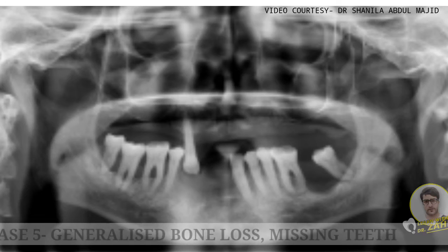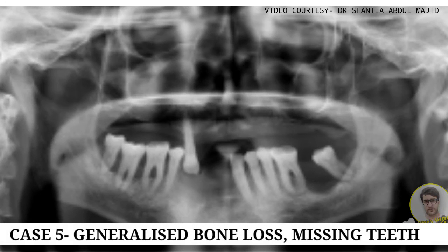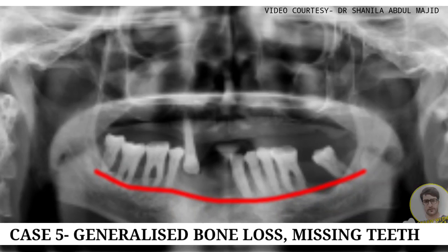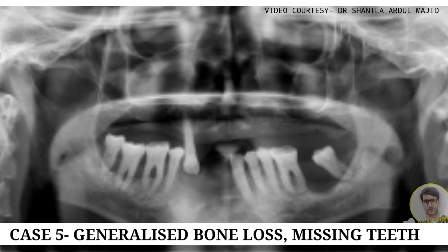The next case scenario is observed for periodontal cases, where you can see there is severe generalized bone loss in the mandibular region and missing teeth have also been observed. You can see here that there is generalized interdental bone loss, more of a horizontal pattern, in the mandibular region.